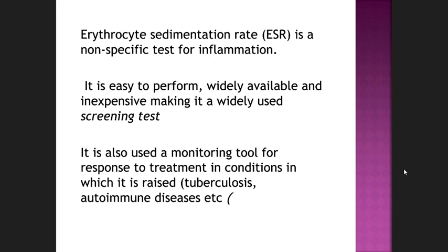So Gaurav, do you want to add something to it? No, sir. I have just said about the Westergren tube in which we perform the test, sir. Okay, I will come to the tube methods a little later. First, a brief synopsis about what the ESR is.